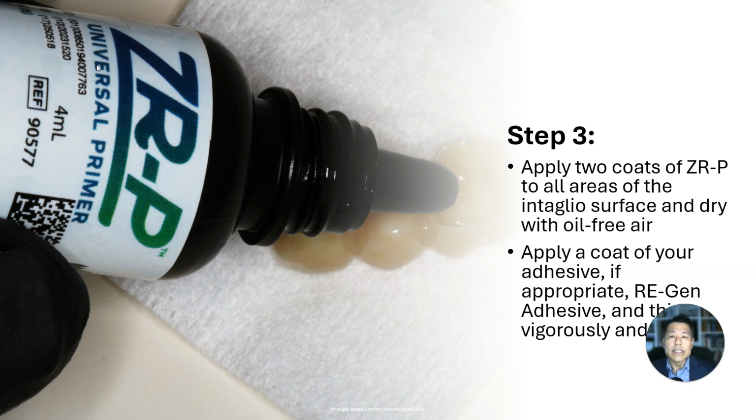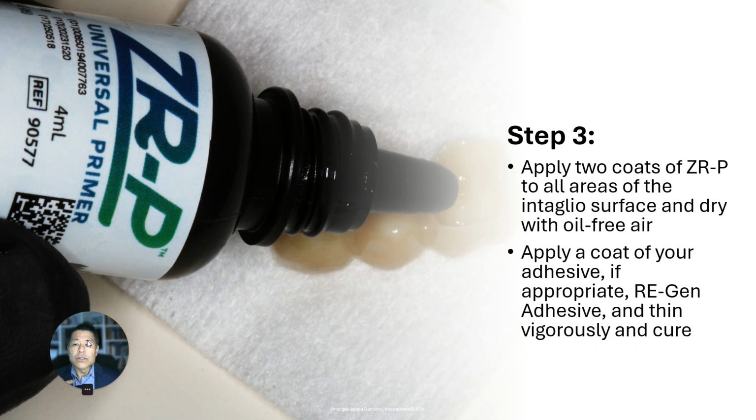I use Regen adhesive because it's a bioactive adhesive, and I just paint that into the intaglio surface of that zirconia restoration, and then lightly air dry it just so we don't blow it all off, because at first the Regen with the bioactive 45S5 glass will have a solvent in it that makes it very runny, less viscous. Hit it with a little bit of air for 5 to 10 seconds. That evaporates out that solvent.